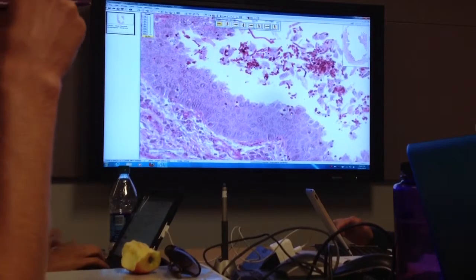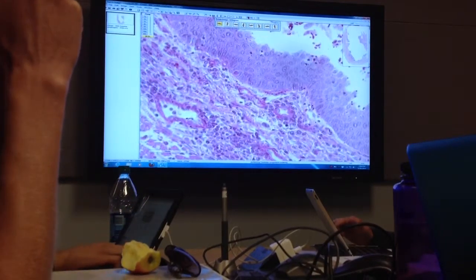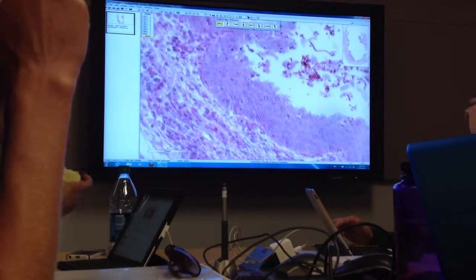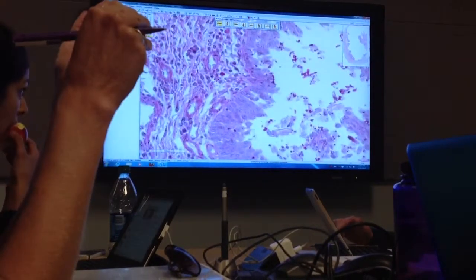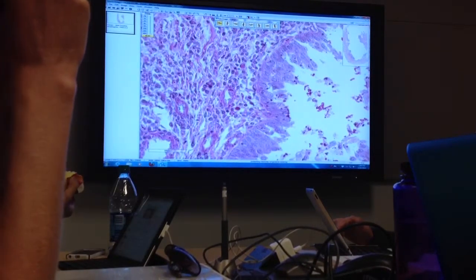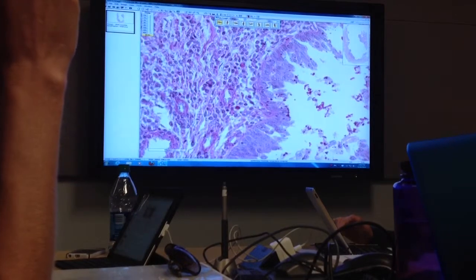These guys here, yes, in every esophageal biopsy, you do see some of this, because let's see if we have any existing. This is kind of a little papilla that goes up and they get squeezed out sometimes during the process. So these are artifact, because you don't see a collection of them like in a fresh hemorrhage. But if you had a severe enough infection, you could have fresh hemorrhage.